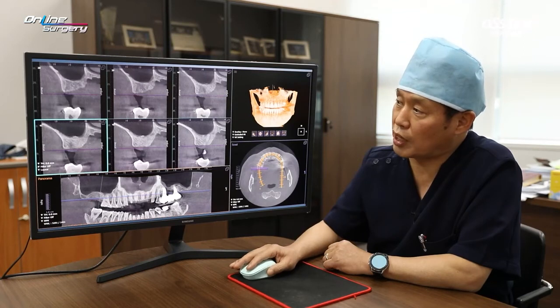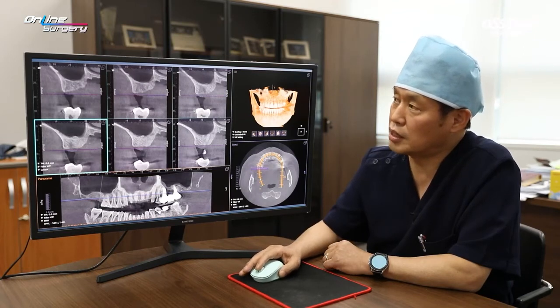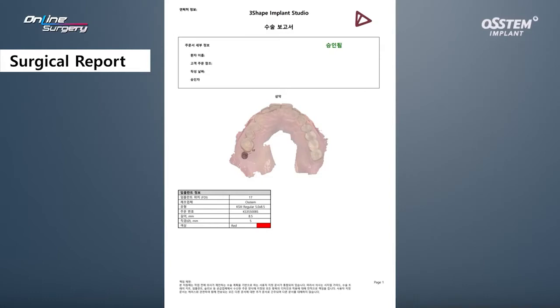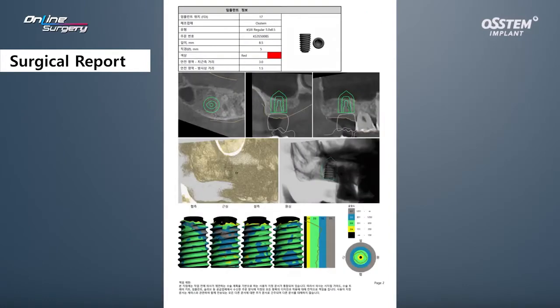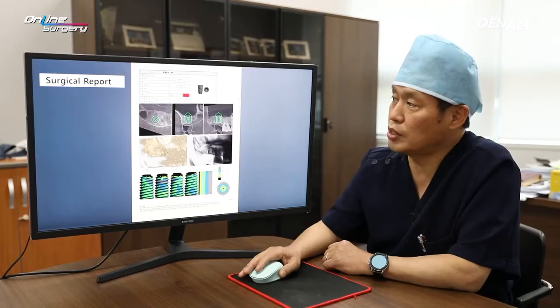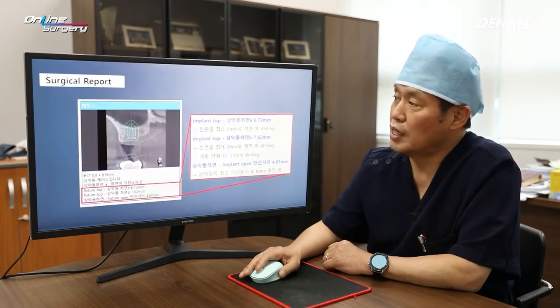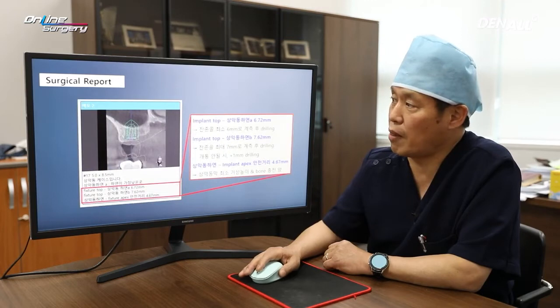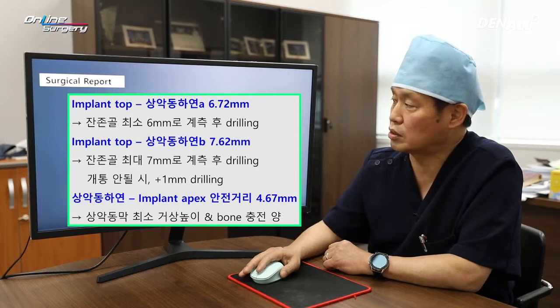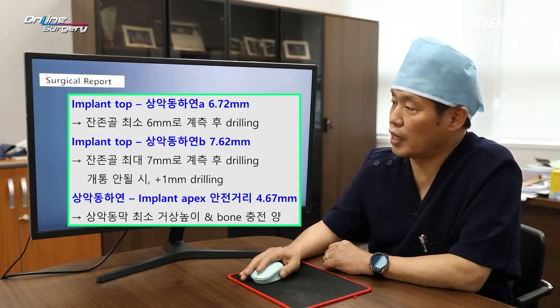Looking at the distal side of number 6, the bone looks quite nice. In order to use the OneCast kit, I came up with a surgical plan. In number 7, there is approximately 6 to 7 millimeters of residual alveolar bone. I plan for a 5.0 by 8.5 millimeter implant. From the implant top to the inferior margin of the sinus, the residual bone is approximately at least 6 millimeters, and I consider 5 millimeters as the safe distance.